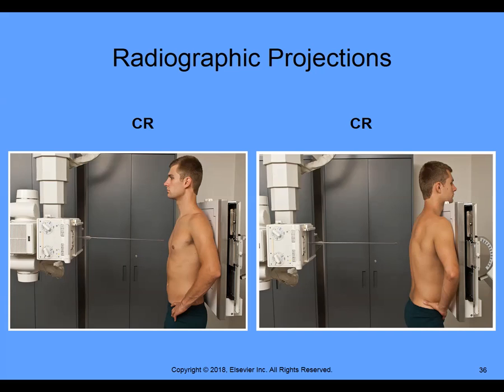So, for example, this first picture that we're looking at, we had said yesterday that we're paying attention to the central ray.